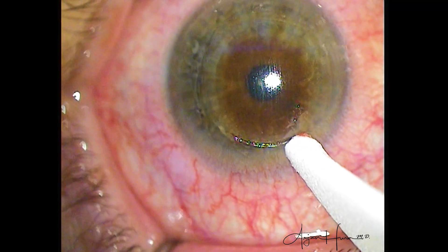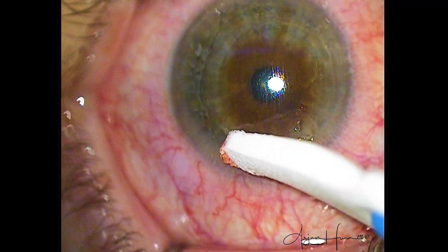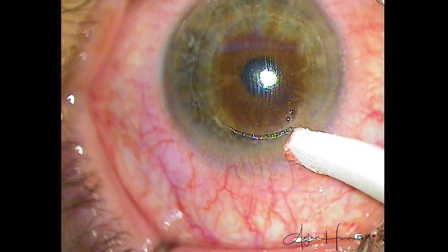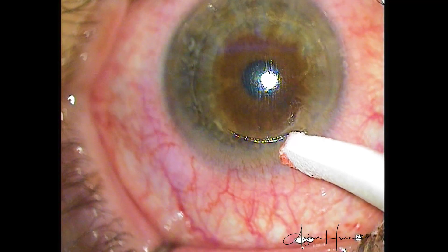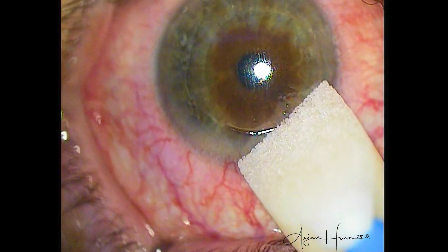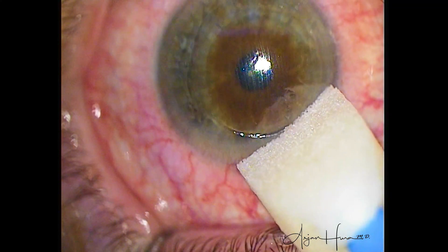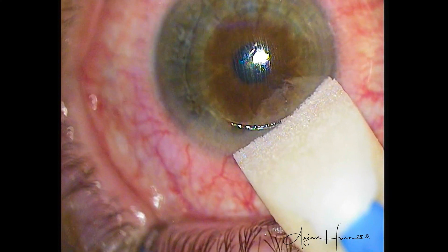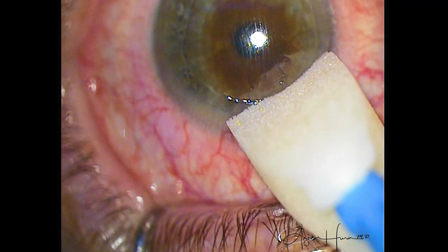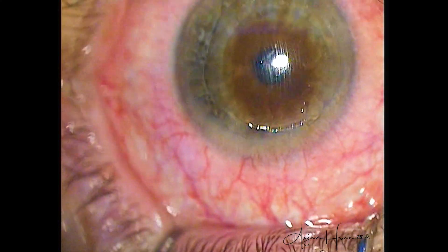I asked my laser technician — who's fantastic and has seen everything in refractive surgery — for a Wex-cel sponge soaked in a vasoconstricting agent: neosynephrine. I hold pressure while he's getting that sponge, and because we're on the same page and he's been watching the screen the whole time, he knows exactly what I need. Here it is — a large Wex-cel sponge soaked in neosynephrine. I'm just going to hold this here for about 15 seconds with gentle pressure, just letting the medication take effect. And you'll see that those oozing blood vessels, now with this vasoconstricting agent on them, are going to stop bleeding. And there it is.